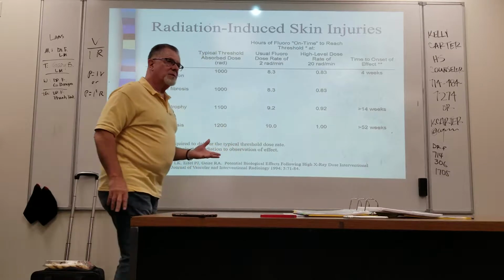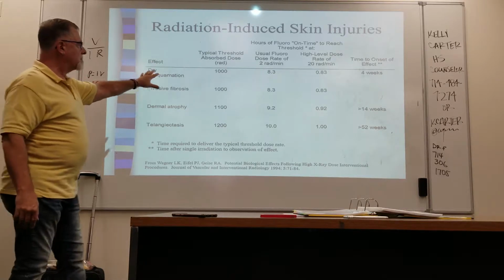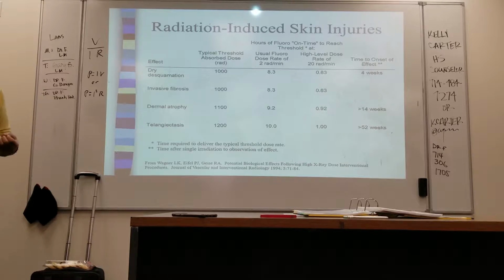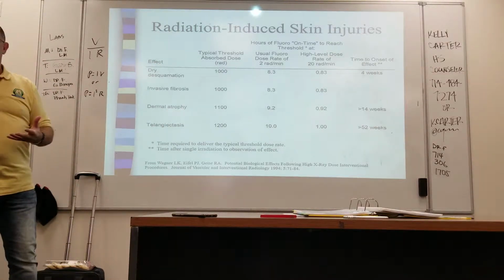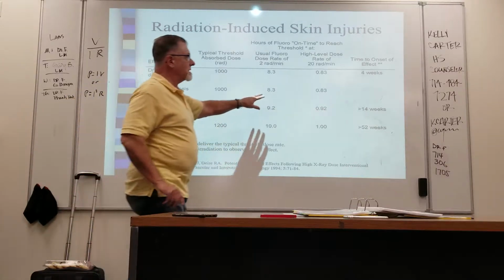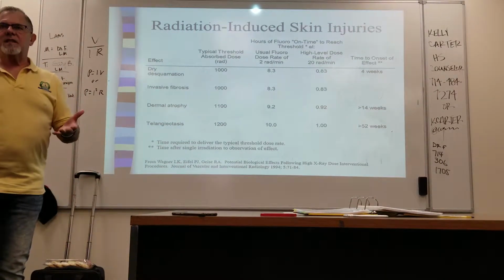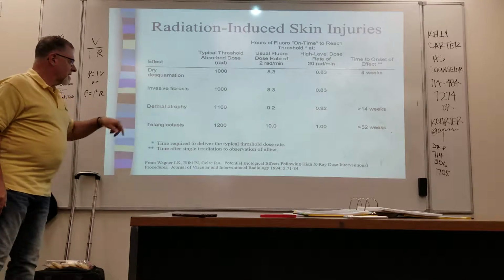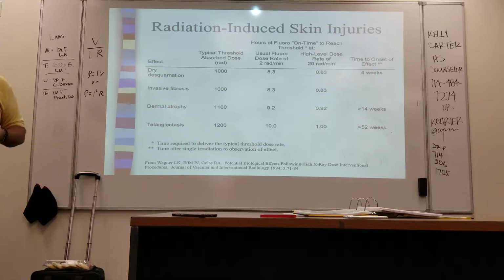So for some of the really high dosage procedures, this is something I always push for and was told, oh, it's not important, it never happens, is for the radiologist to look at what types of dose the patient could be anticipated to get and make sure that something is mentioned in the consent, letting the patient know. For erythema, it's easy. Couple of days, come back, call me. But you're looking at stuff that, and there are exams that deliver these kinds of doses. You're looking at 4 weeks, 14 weeks, 52 weeks. For the patient, then something comes up, the patient looks at it and says, well, what's this? They go back, they look at their referring physician, the referring physician looks at it and says, well, I don't know what it is. So I think that's something, hopefully it will come in the future, that radiation dose and potential effects need to be part of that consent.